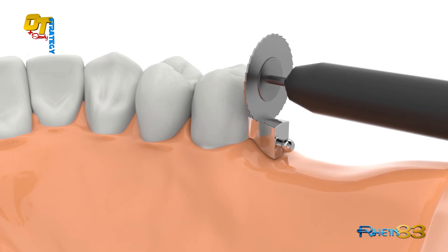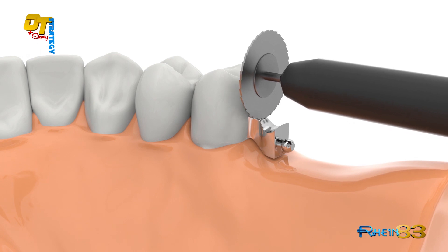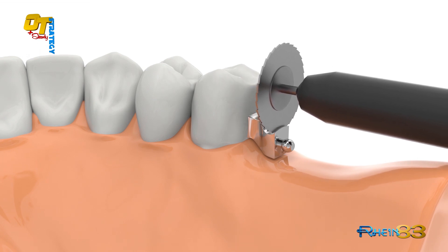Finish the cast attachment following the ridges' distal shape. Do not over polish the strategy sphere.